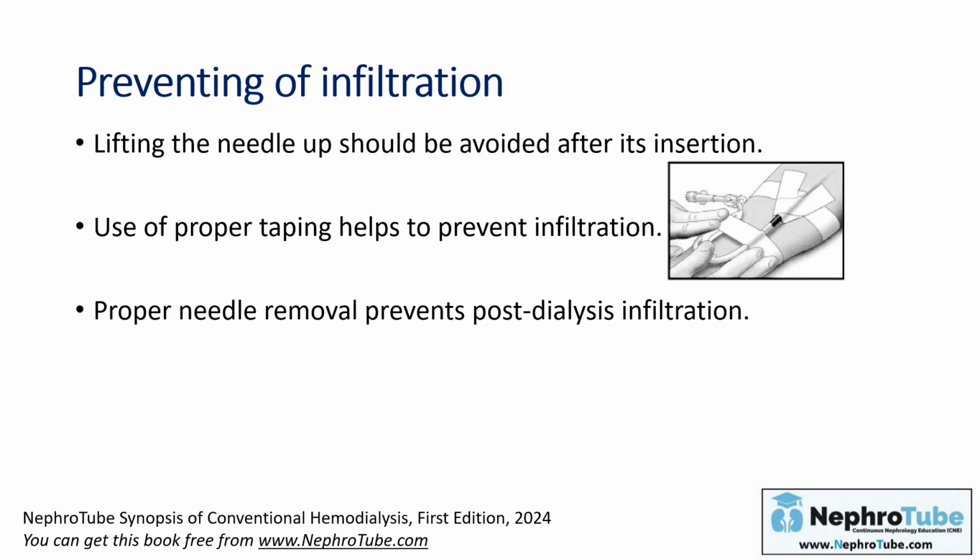This is done as follows: before the needle removal, you have to apply the dressing over the needle site, but don't apply pressure yet. When the needle is in the vein, don't apply pressure by the dressing. Then carefully remove the needle at the same angle of insertion. Once the needle is removed, apply pressure by the dressing. But while you are making pressure, be sure that you are occluding the tract of the needle only, not occluding the fistula itself.